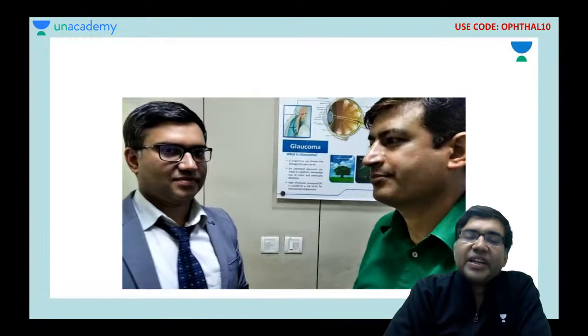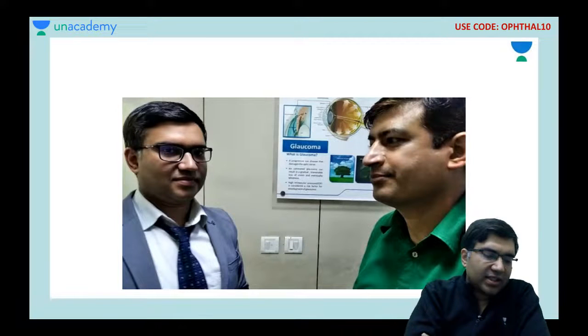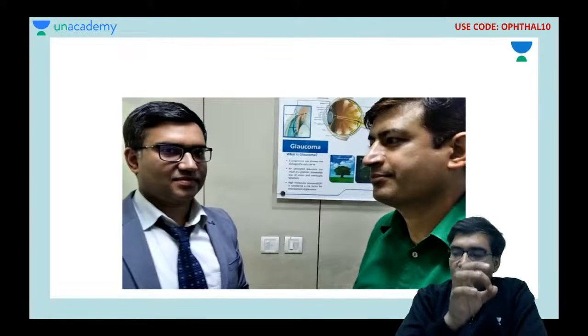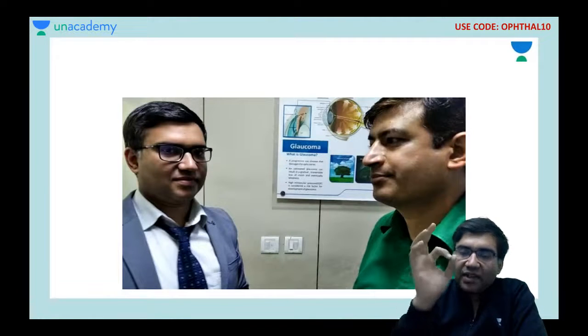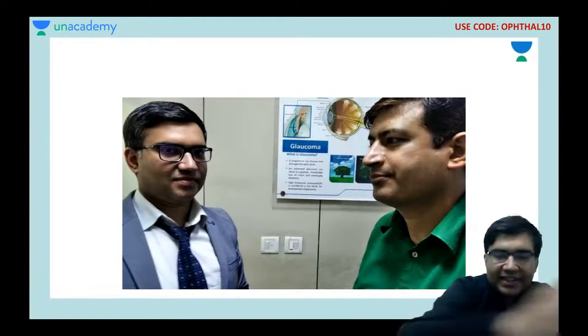So what are the various questions they can ask from this? Let's say I am seeing from my right eye towards the right eye of the patient. The image that is formed of the optic nerve is virtual and erect. Remember, you can remember it with the mnemonic Dev. Okay, I write it here.